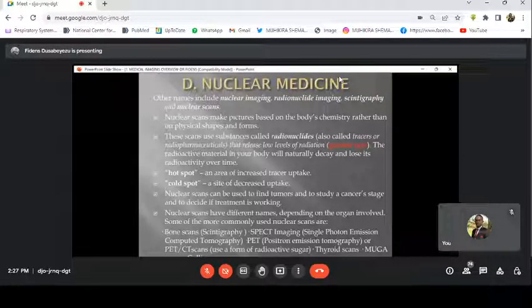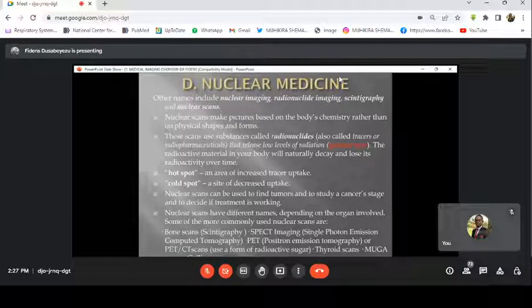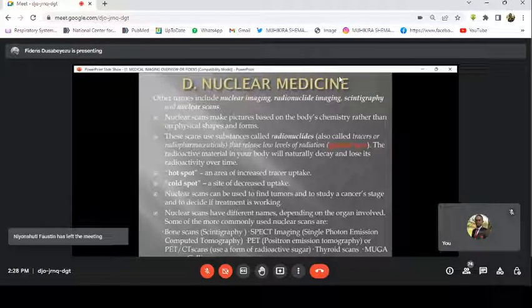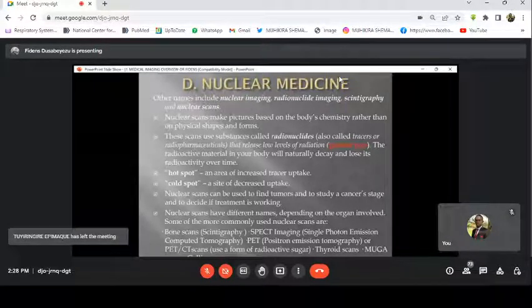All right. The difference between nuclear medicine and the other modalities we have seen already is that the X-rays don't come from the machine to the patient. Here it is opposite. The energy is coming from the patient to the machine. Why? You inject those substances we use, called radionuclides or radiopharmaceuticals, in a vessel, in a vein, or swallow it, or even inhale it. Now, when that substance is in the body, you put the patient in the machine. As those substances decay with time, they produce some energy going into the machine, and now the machine can recognize where the problem is. Can you get it?